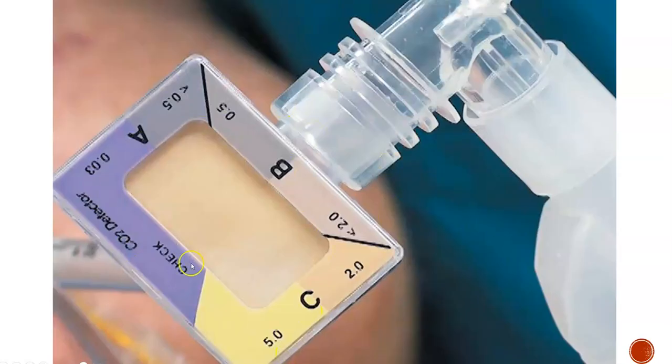Okay, so this is our end-tidal CO2 monitor, or detector monitor, however you want to say it. This is what's going to be attached to the end of that ET tube to help detect CO2 to make sure that we're in the right spot. So basically, normal end-tidal CO2 values average 2 to 5 millimeters of mercury less than the PaCO2 in individuals with normal lung and cardiac function. So each time we take an ABG, our end-tidal CO2 value should also be noted.